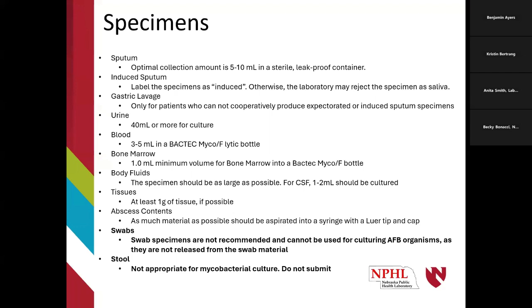First, I'm going to go through some specimens. The obvious sputum samples we're going to get primarily to rule in or rule out M. tuberculosis. Since Nebraska Medicine functions as the state TB lab for Mycobacterium tuberculosis, once a patient has been identified as positive for tuberculosis, we then become the health lab for that, and we are sent all of the follow-up cultures from any of the health departments in the state.